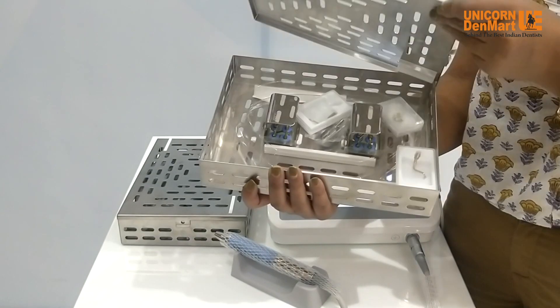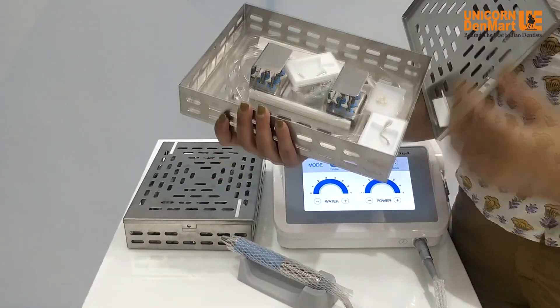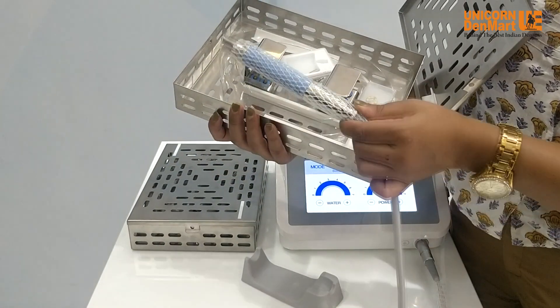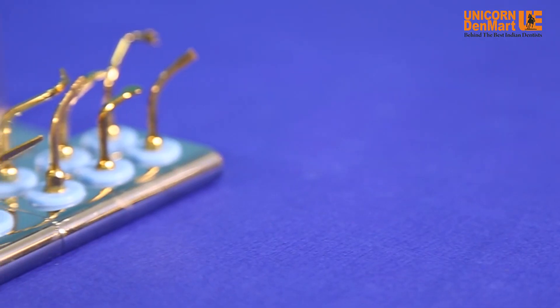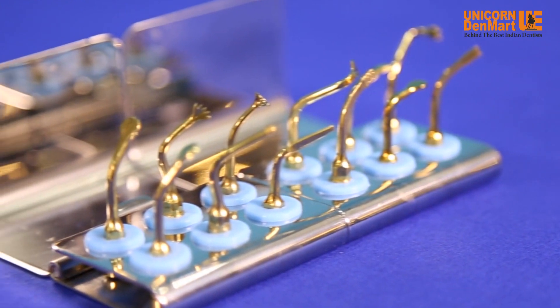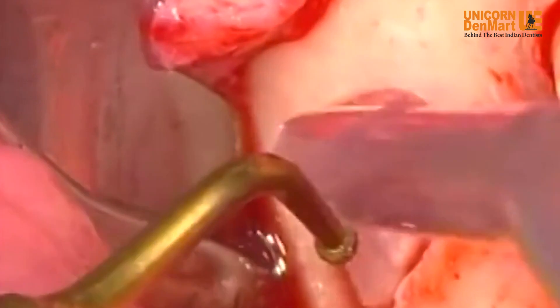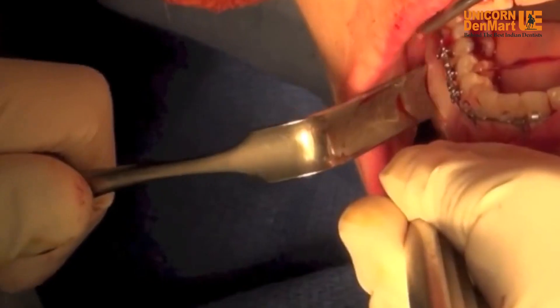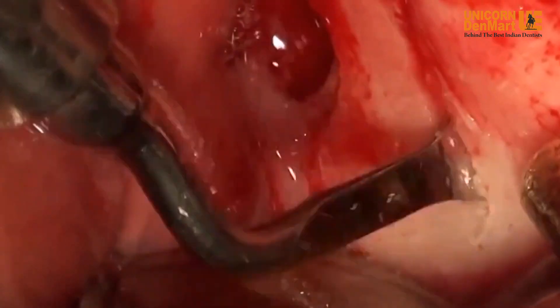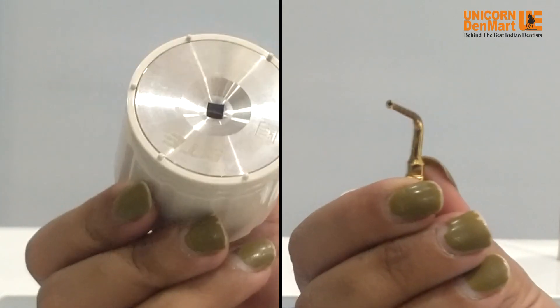Surgery X has two sterilization cassettes — one available with an LED handpiece and 14 tips, and another cassette with the second LED handpiece. Surgery X offers 14 versatile tips for performing multiple procedures, including direct sinus lift, indirect sinus lift, ridge splitting, osteotomy, micrometric bone cutting, extraction, impaction, and many more.